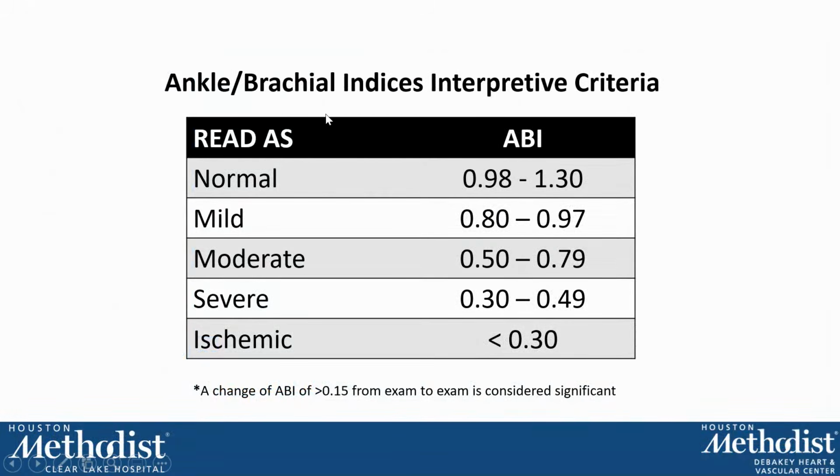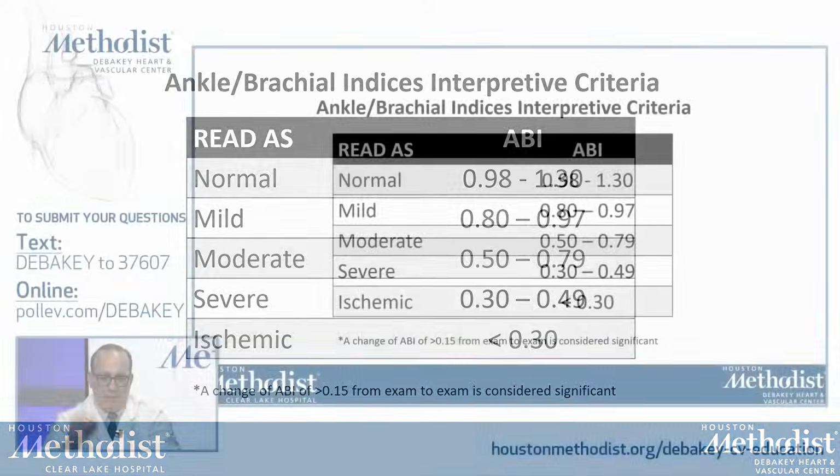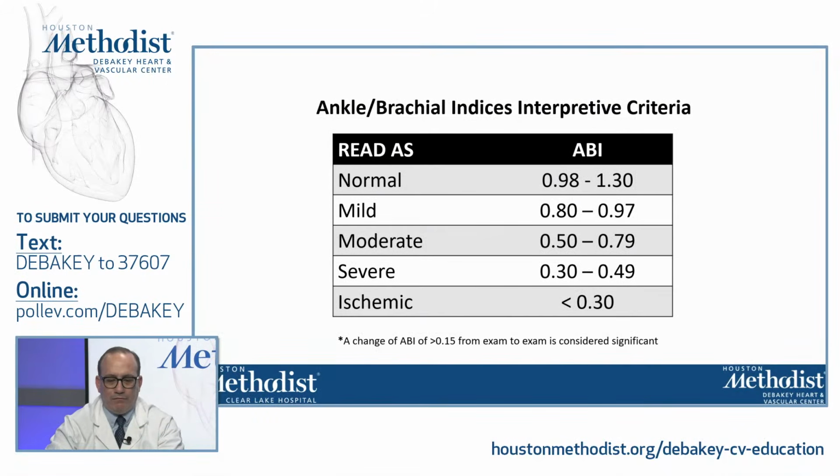So this is important. You have to know what an ankle brachial index means within normal vessels or non-calcified arterial walls that are actually compressible. When you have arteries that are super calcified, especially in long-standing diabetics, you can't compress the artery. The artery is tight enough that all you have is a pipe that's circulating blood flow. And so these measurements have to be considered within that context.